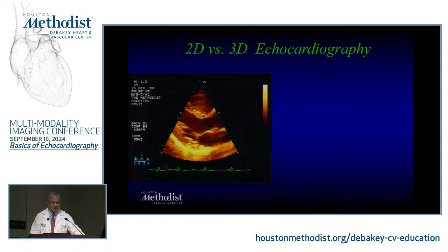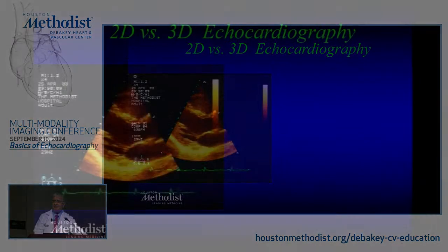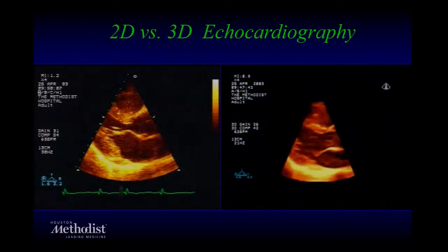Well, this is when we acquired 3D. This is April 2003, so 21 years ago. And the volunteer here was one of our fellows who was attending somewhere. I'm not going to tell you where. Not too far from here. All right? And that's the beauty.